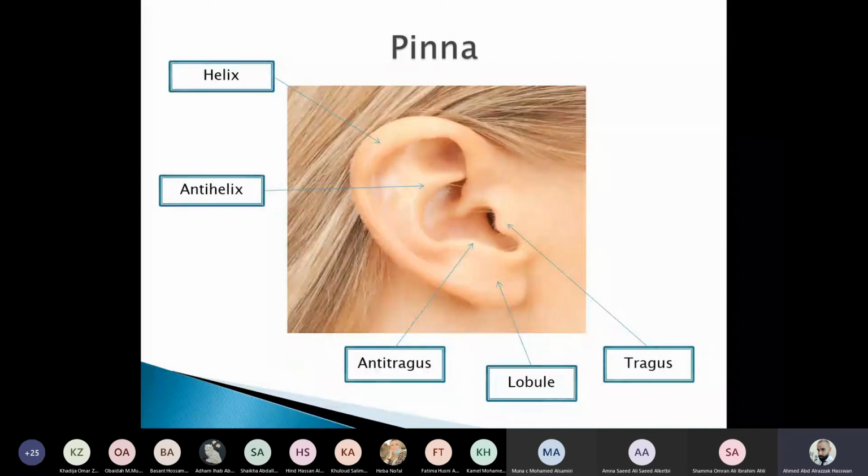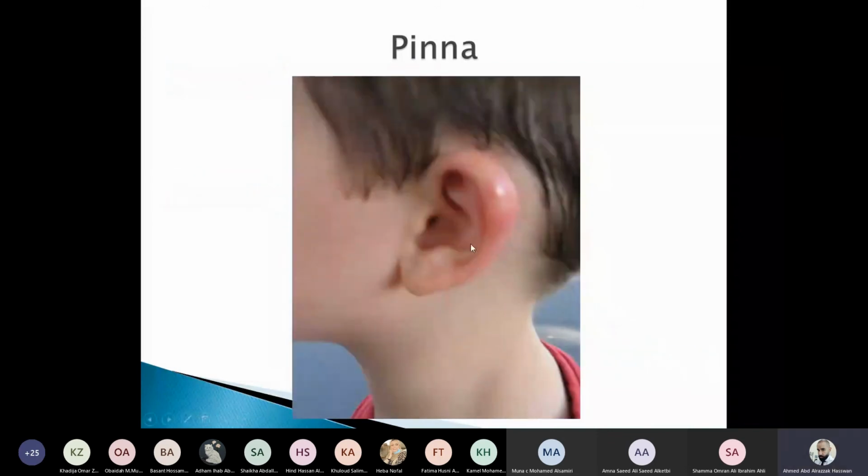So, guys, what can you see here? This child. Can you see any abnormality? Now we're inspecting the external ear. And of course, this doesn't need the otoscope. This is done by just inspecting or looking at. Yes, Abdurrahman, thank you. So this is swelling. Thank you, Bushra Hadi. So can you see this swelling? Okay. So clearly here, it's red and swollen. Yes, so the helix is swollen, or we can just say the pinna is red and swollen.